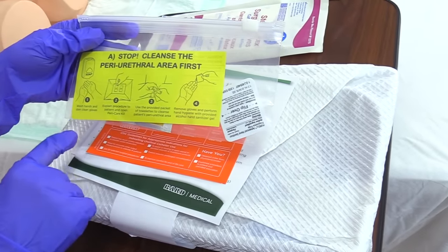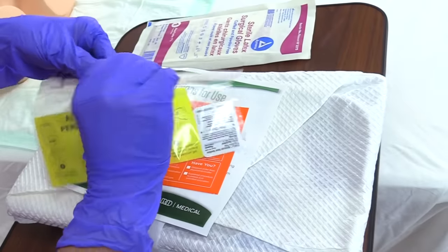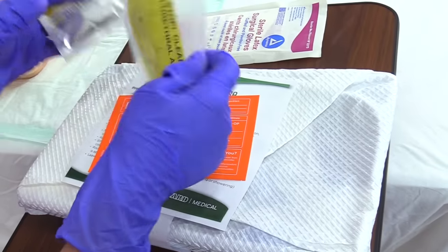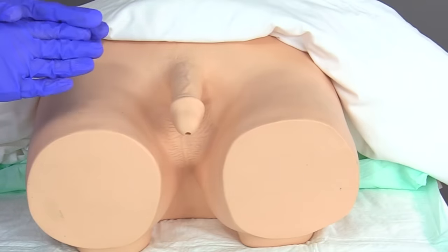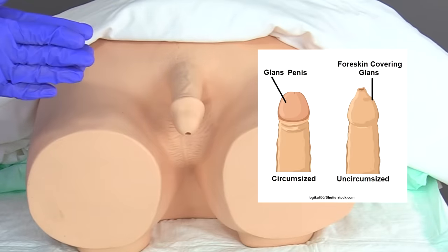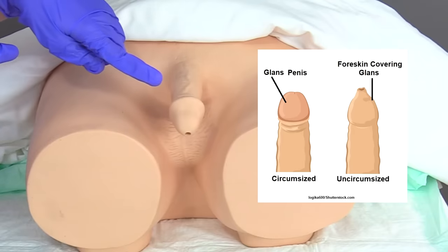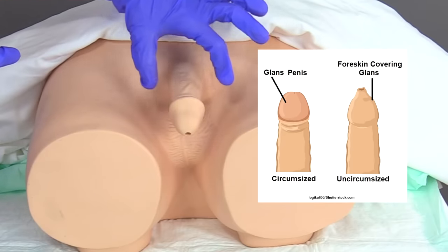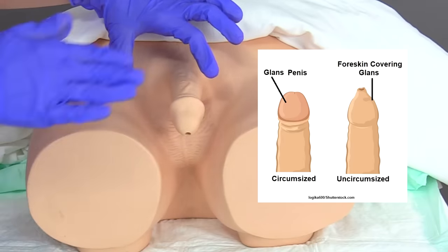We've already washed our hands, donned clean gloves, and explained the procedure to the patient. Before providing peri care to the male patient, you want to assess the penis — determine if it's circumcised or uncircumcised. If the patient is uncircumcised, there would be a fold of skin covering the glans (head of the penis), and this skin must be retracted back to expose the urinary meatus and glans so we can clean the area.